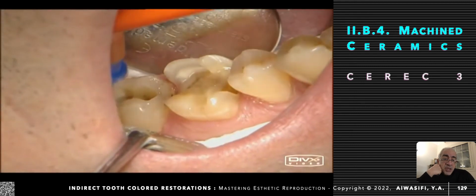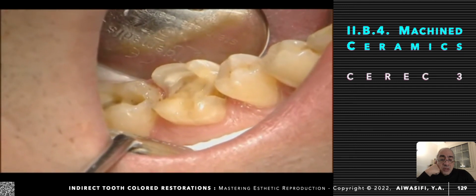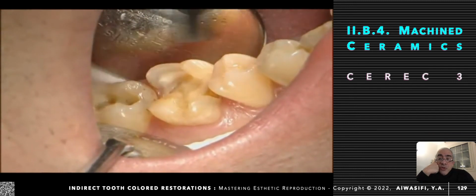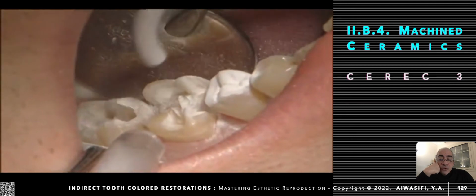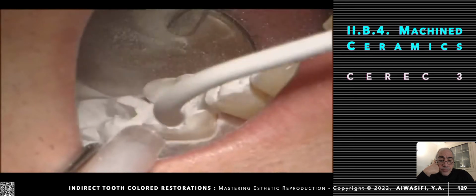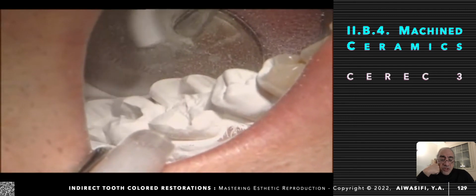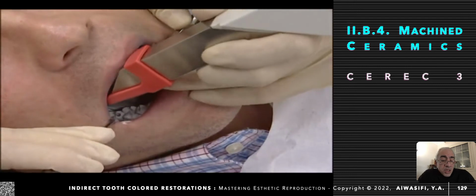He is using a special adhesive for the anti-reflection powder. Okay. Then spraying the anti-reflection powder, which is titanium oxide, to avoid any reflection spots that will destroy the accuracy of your image. Sufficient amount is sprayed to ensure that there is no reflection.